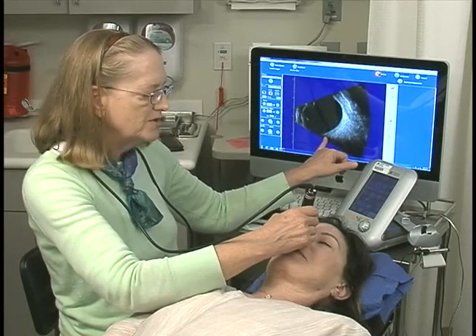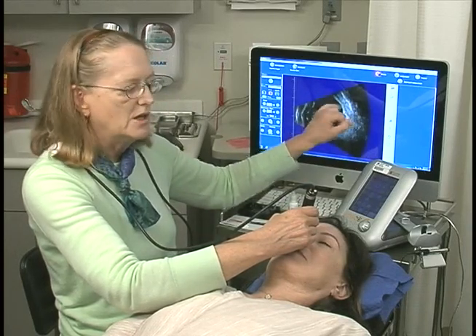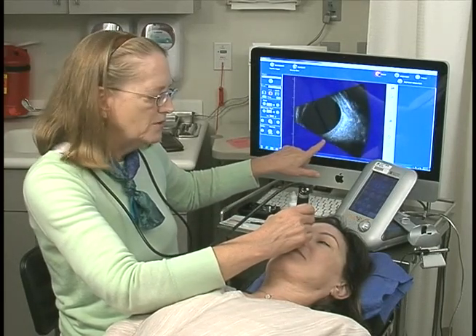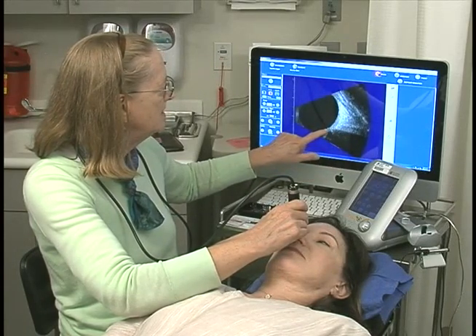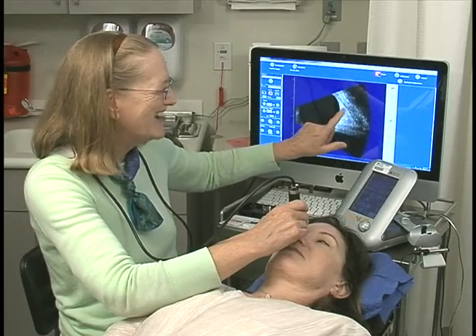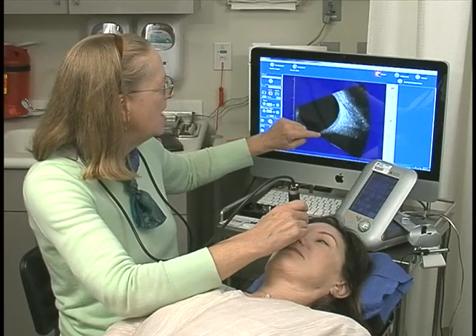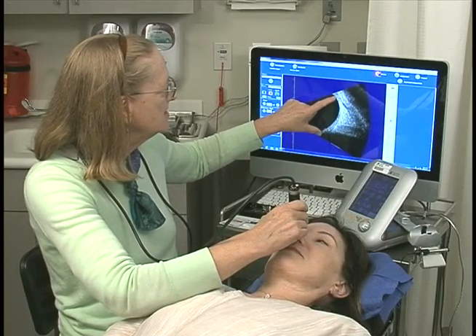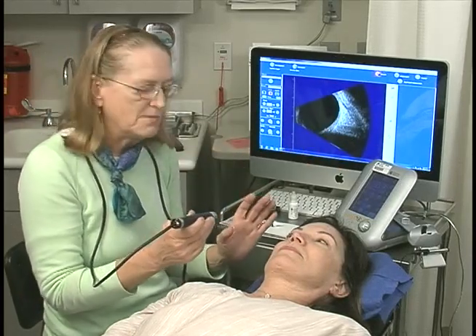The posterior segment is at the bottom, and the anterior periphery of a particular clock hour is at the top. So this is 9 o'clock posterior. Here's the optic nerve coming into the eye, which is a little tiny elevation. This is the medial rectus muscle, the lateral rectus muscle, the belly, and the inserting tendon. When I have the optic nerve insertion and the lateral rectus inserting tendon in the same view, I know exactly that I'm imaging the macula because I know that the macula lies on that meridian.